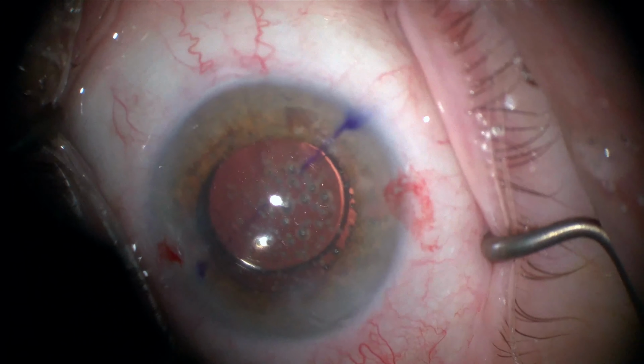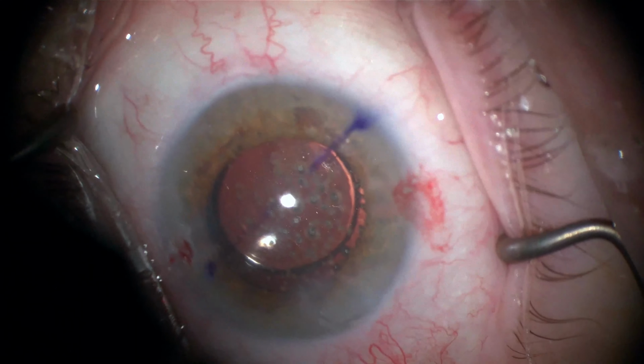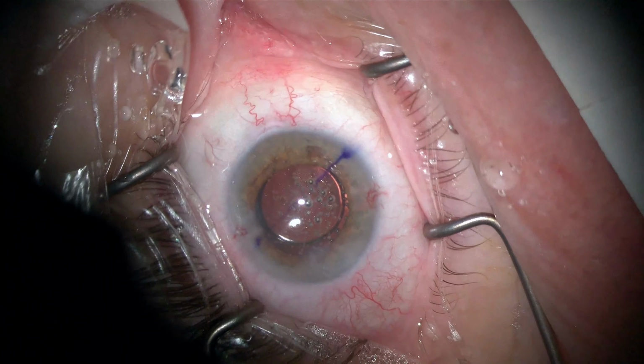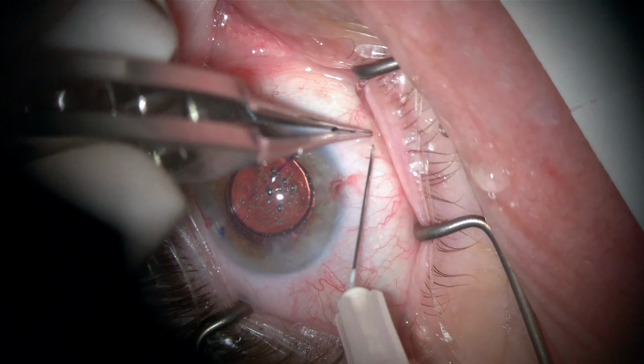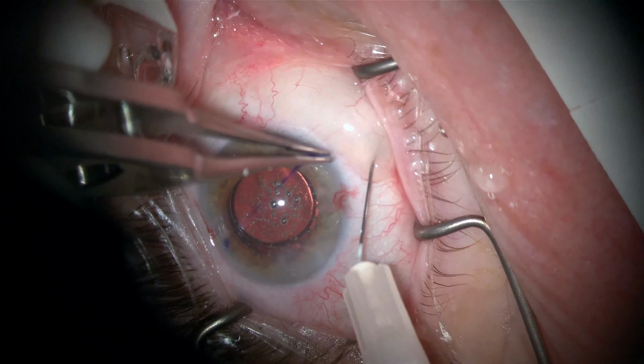And once I'm happy with that, I confirm the toric IOL position. Whenever there's some parallax, I like to make sure that the corneal line that I make is parallel to the toric axis markers, which in this case I was happy with the positioning.